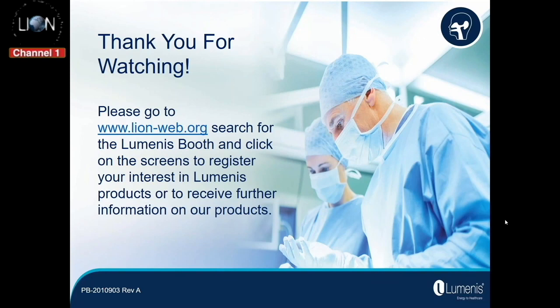On the left of the screen is an example of a complete starter kit, which includes a box of 12 curved tips, 12 straight tips, a straight handpiece, and a curved handpiece. So here's an example of the complete assembly of the OtoLase kit. Firstly, we have the fiber, which is the piece that connects into the system, which is either the AcuPulse Duo or the UltraPulse Duo. Covering that fiber, we have the sterile drape. And the fiber is connected to the handpiece, either the straight or the curved handpiece. Finally, to complete the assembly, the straight or the curved tips are connected to the handpiece.